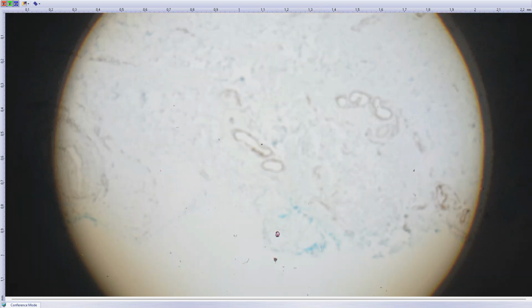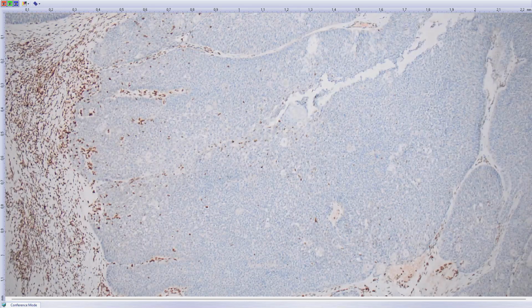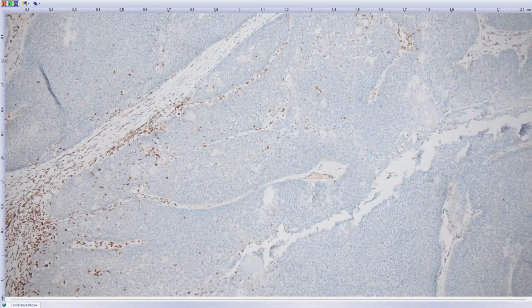It's extraocular in localization. So the next step we have to do is to screen for Lynch syndrome variant called Muir-Torre syndrome, and in fact the lesion was immunohistochemically deficient for MSH2 and MSH6 staining. So we've got loss of staining, and this is, let's say, suspicious for Muir-Torre syndrome.